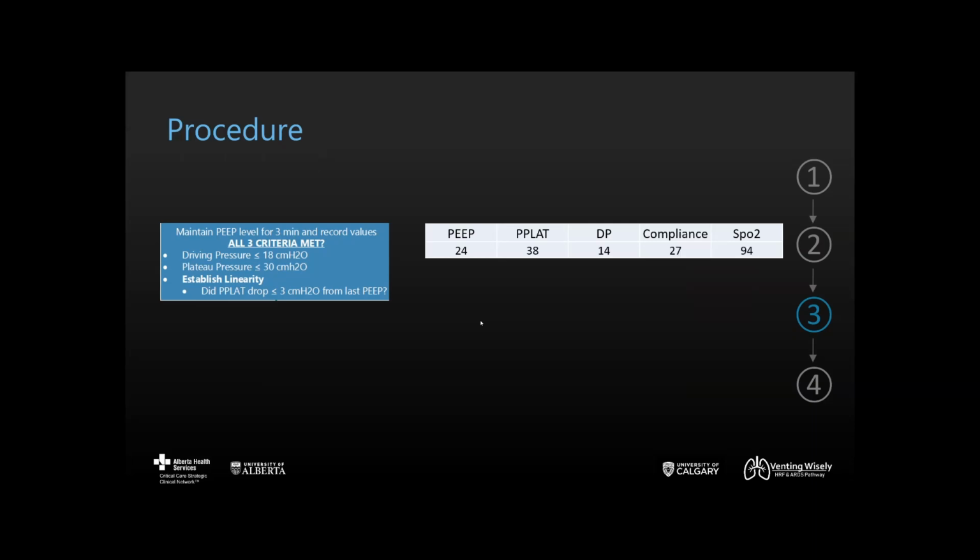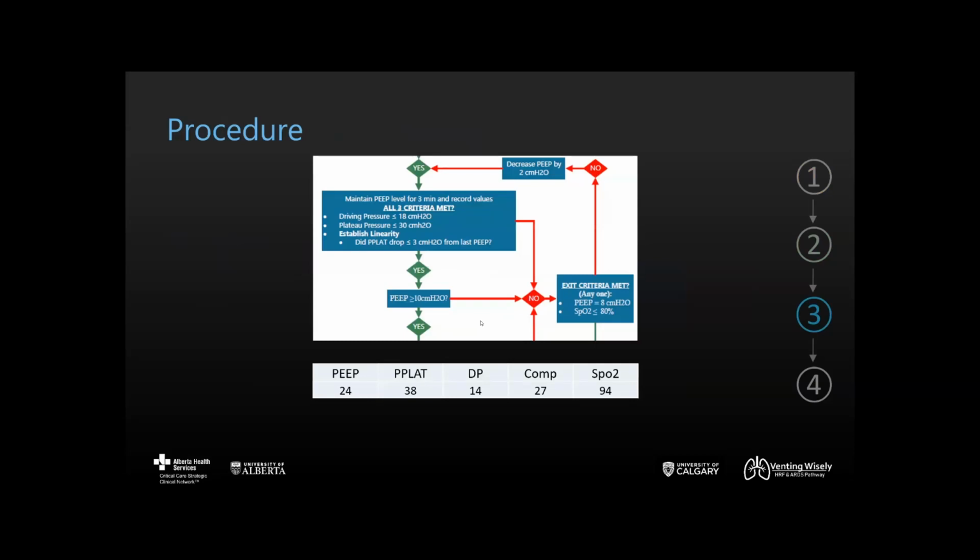Driving pressure less than 18? Yes. Plateau pressure less than or equal to 30? No. Then follow the red arrows on the algorithm. Following the red no arrow, we come to another question. Is the exit criteria met?